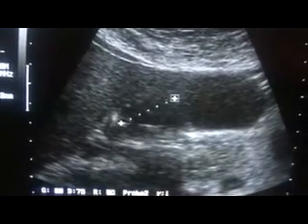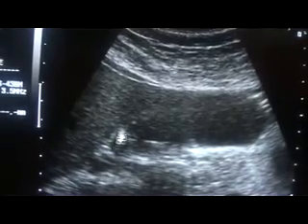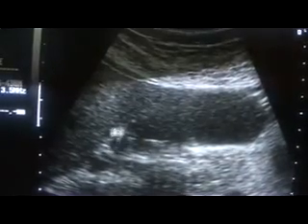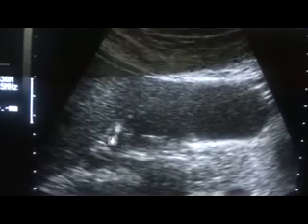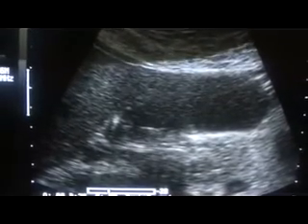Now you see there are many. You can see this echogenic area, this echogenic. These are all calculi now. They have come down and are in the neck region, giving posterior shadowing. So these calculi are mobile.